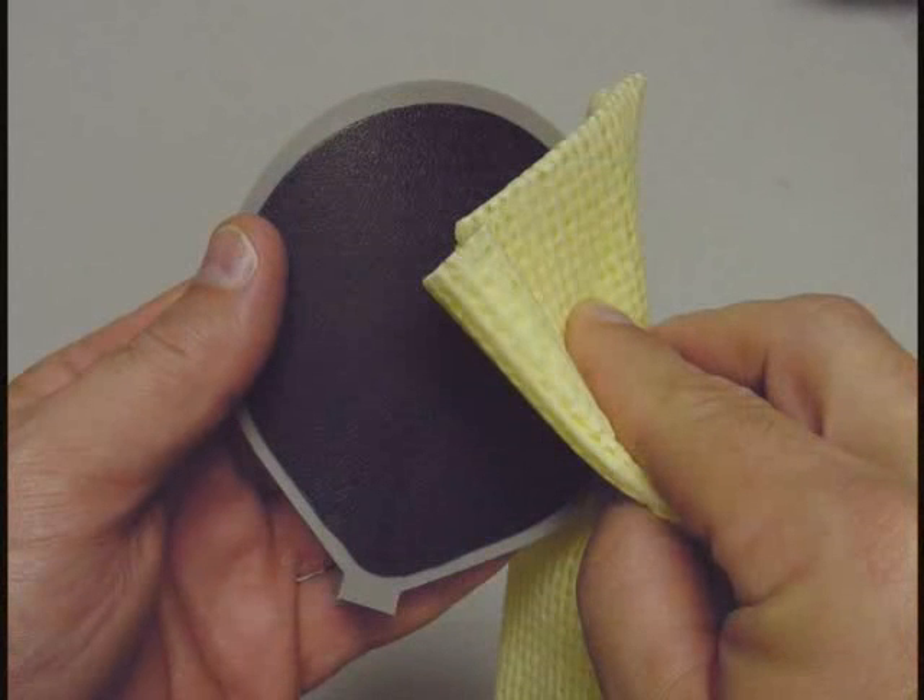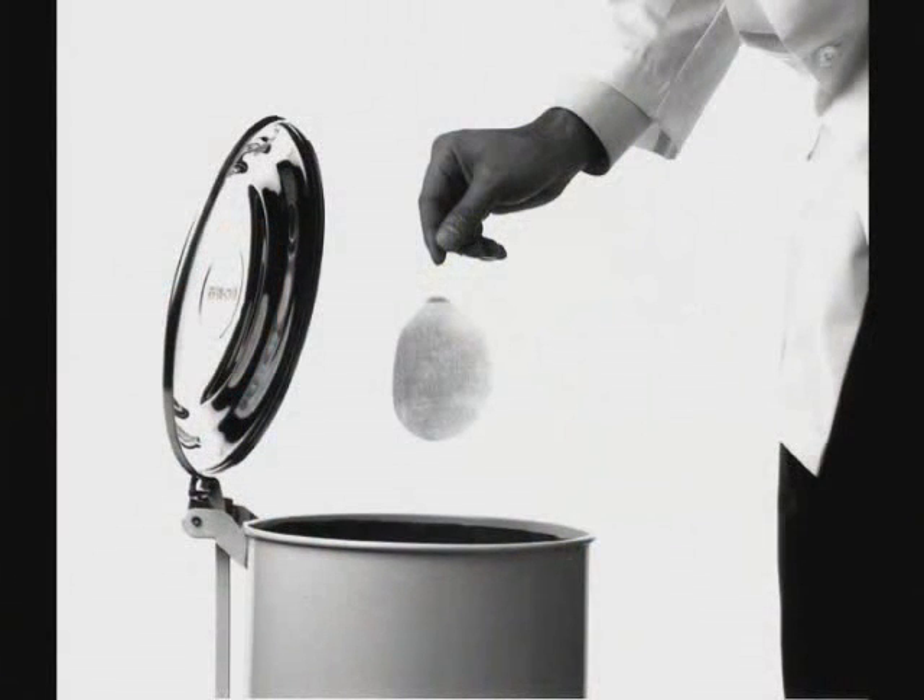Thoroughly clean the pads with warm water and dispose of the used cloth covers after every treatment.